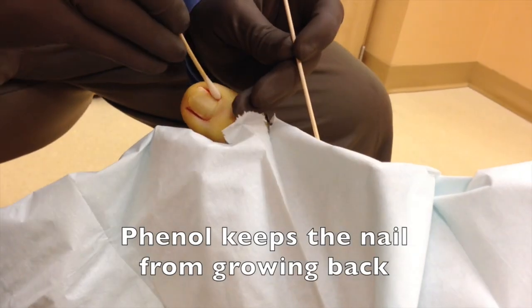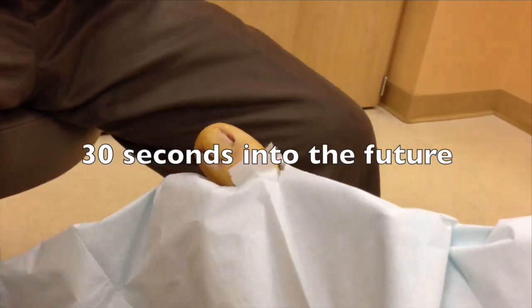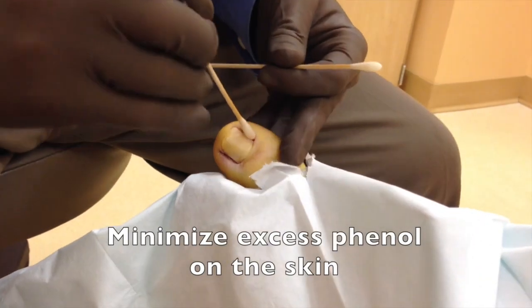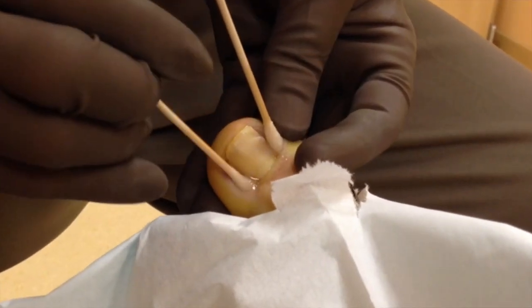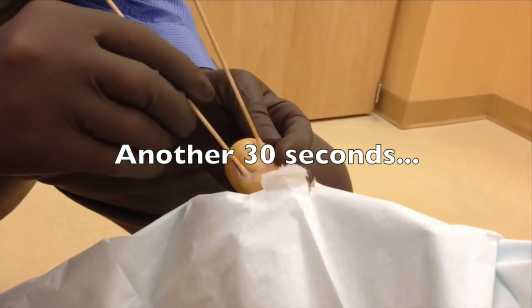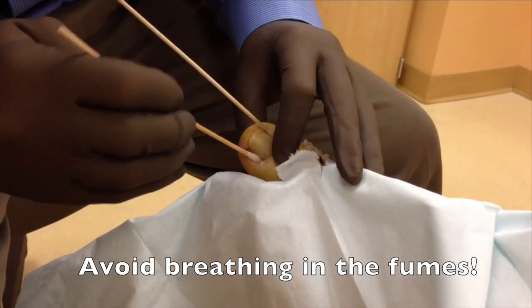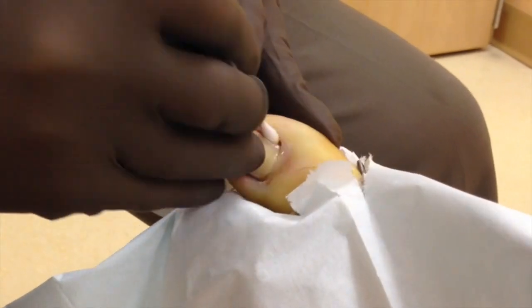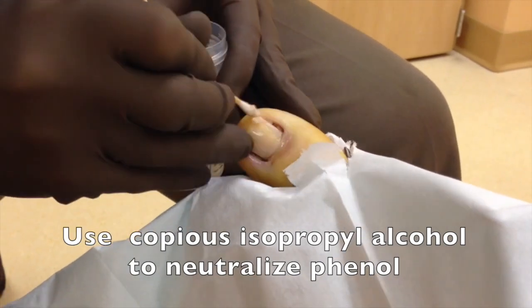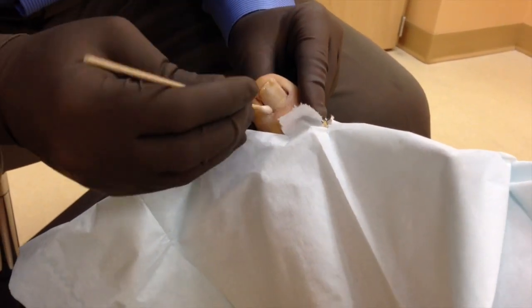If we want permanent nail removal, use phenol. Apply phenol for three separate applications of 30 seconds each. We only need the phenol to kill the nail matrix, so using smaller swabs helps keep the phenol from contacting other tissues. Phenol is super caustic, so you don't want to breathe this stuff. Isopropyl alcohol neutralizes phenol — apply it with a clean swab, or use several isopropyl alcohol wipes.